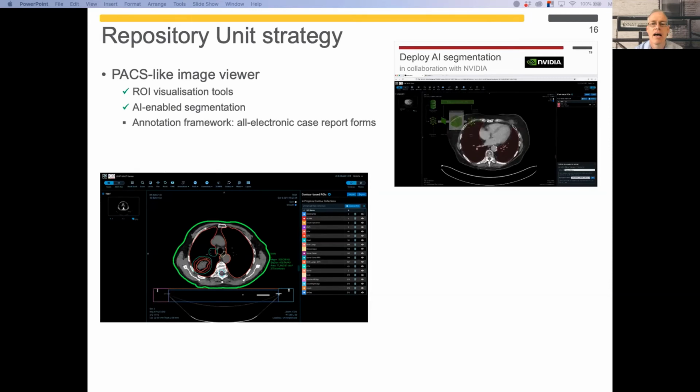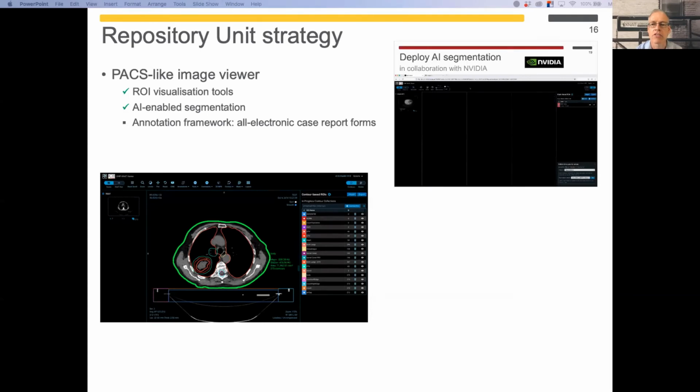We've also added numerous additional tools for manual refinement of these AIAA results, but there's a lot more work to be done to combine these tools with more comprehensive electronic case report forms, and we'll be talking about this more in the town hall session tomorrow.